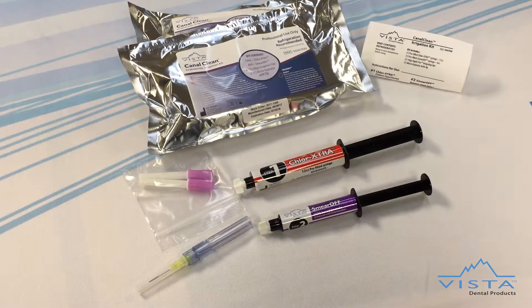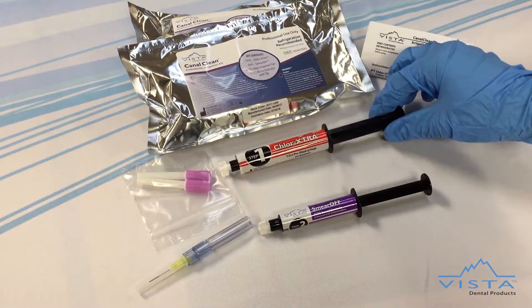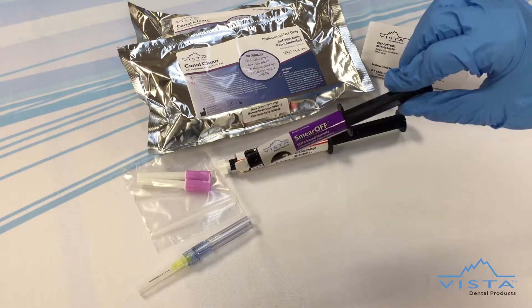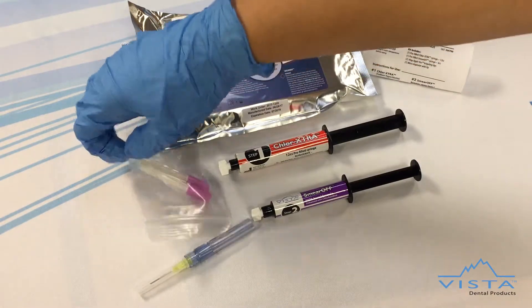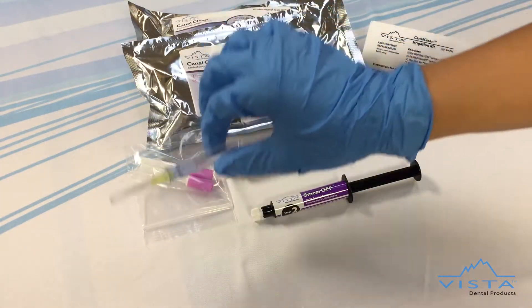Canal Clean includes Chlorextra enhanced sodium hypochlorite, Smear Off two-in-one, 30-gauge side-vented irrigating tips, and a micro-aspirator for canal evacuation.